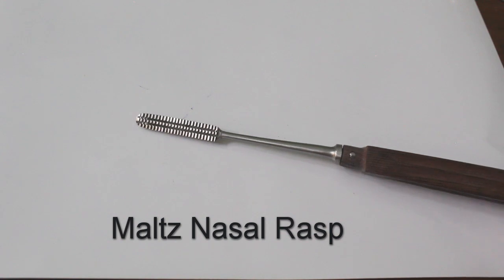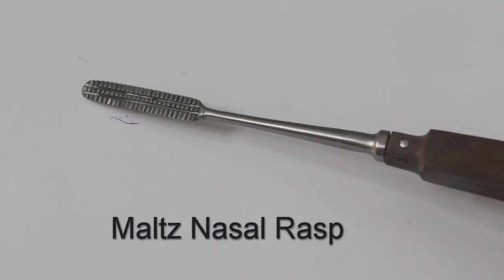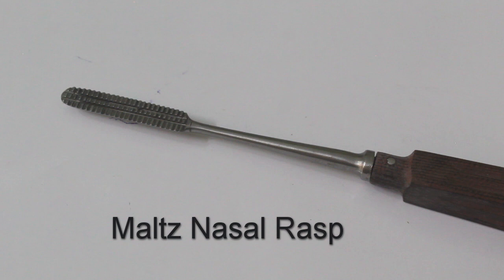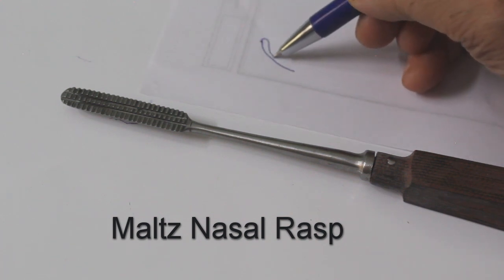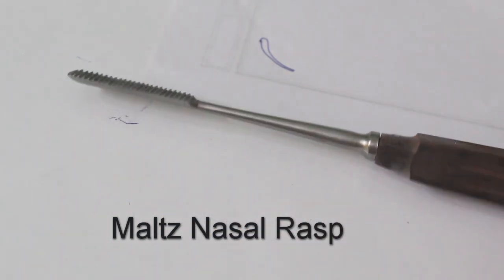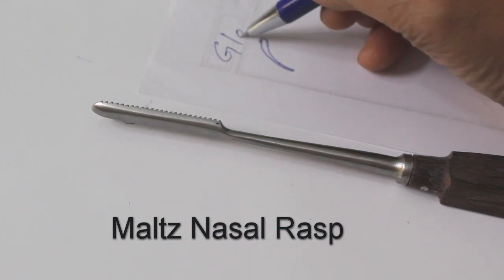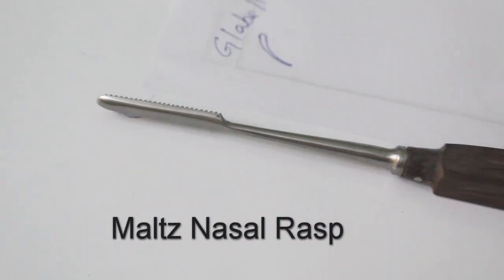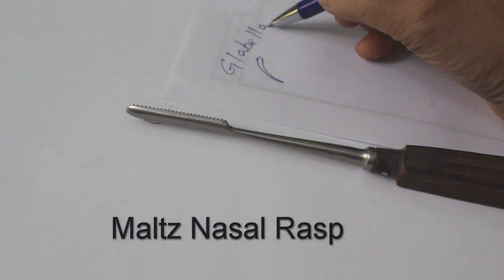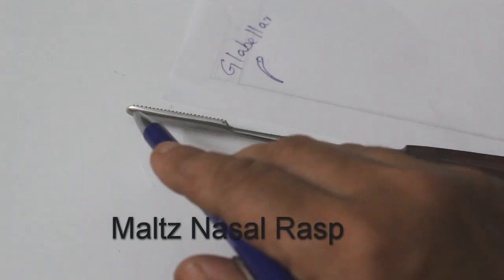For rasping the nasal hump, different types of rasps are available. See the tip — various rasp designs exist. For the glabellar area, a curved rasp called a glabellar rasp is used. All other rasps have a straight rasping surface — only the glabellar rasp is curved.